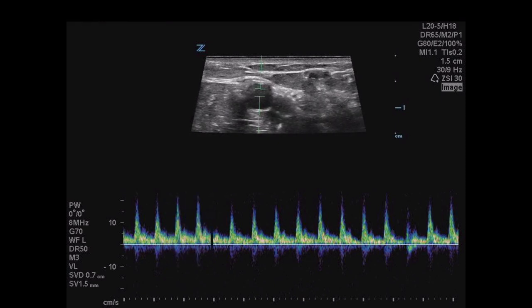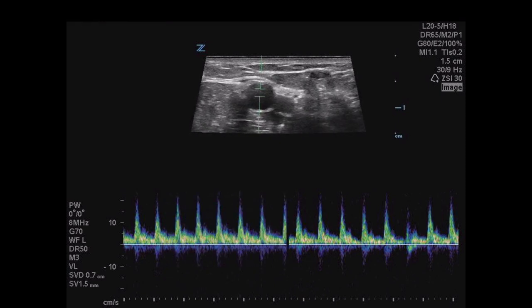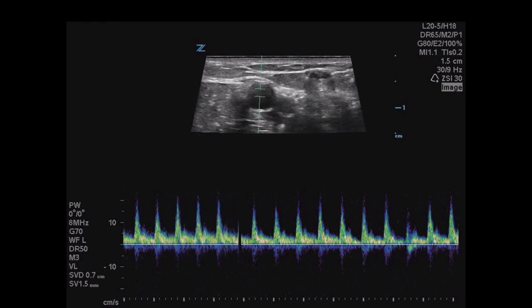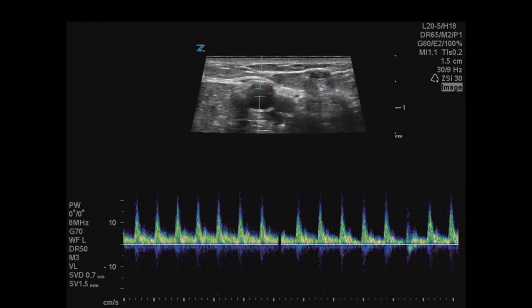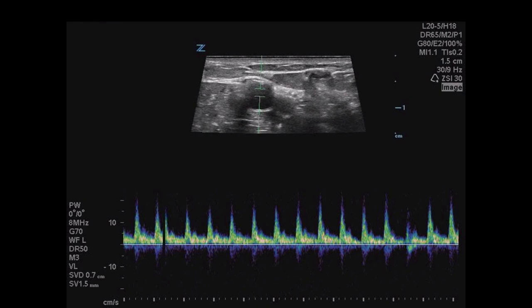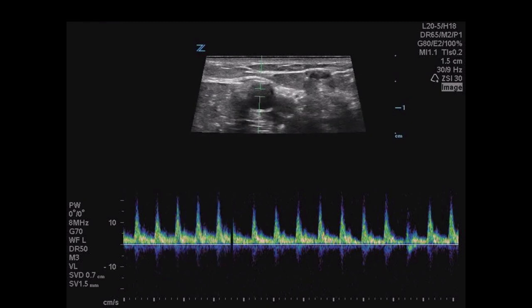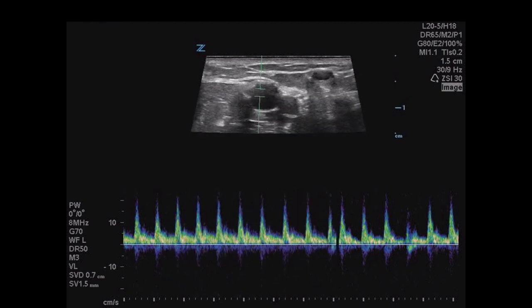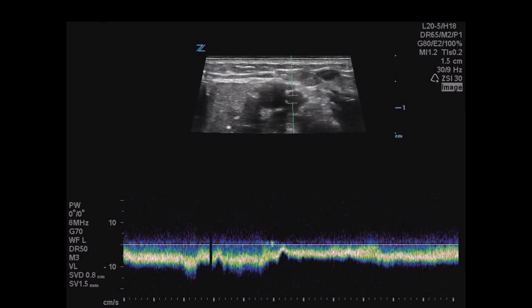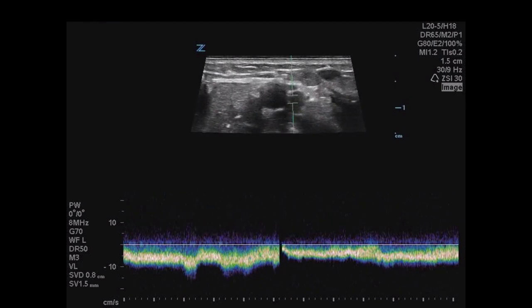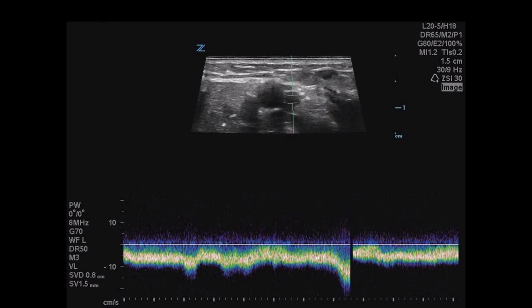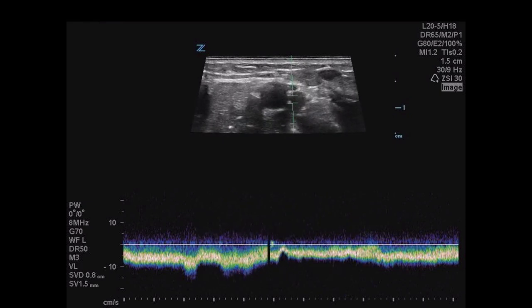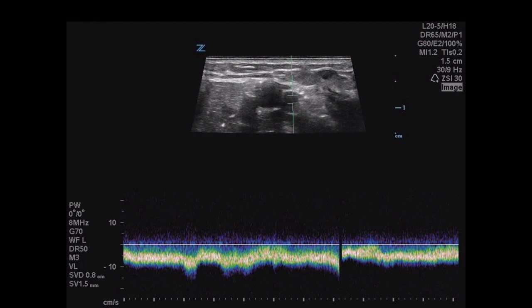With the Doppler gate within the vessel lumen, a brisk upstroke and high systolic peak tells you it's an artery. If your machine has audio, you'll hear that arterial pulsation familiar from handheld Doppler. In contrast, when you place the gate over a vein, you'll see an undulating pattern without repeated systolic peaks, and you'll hear more of the venous whooshing sound.